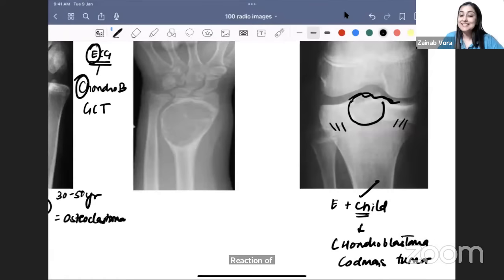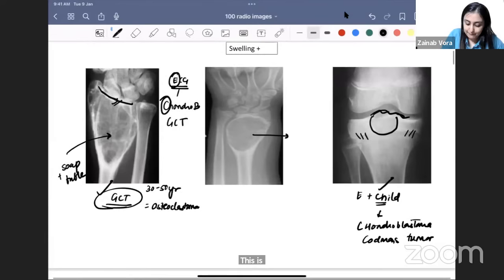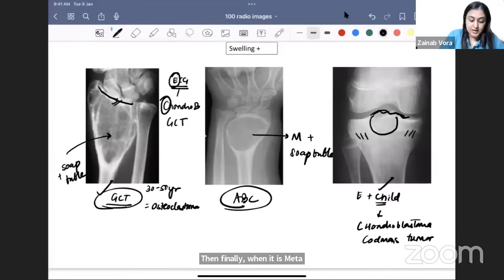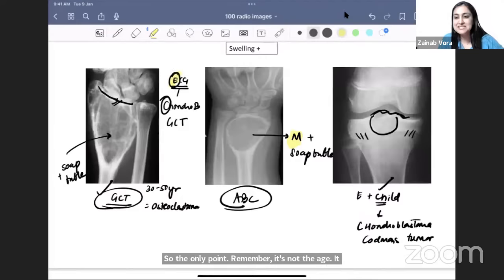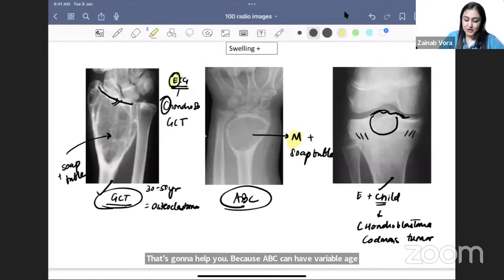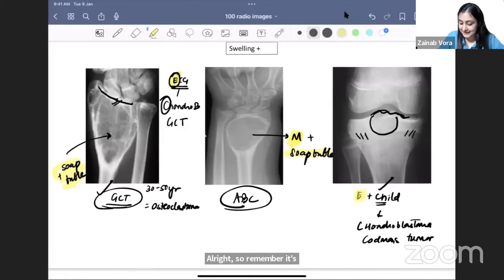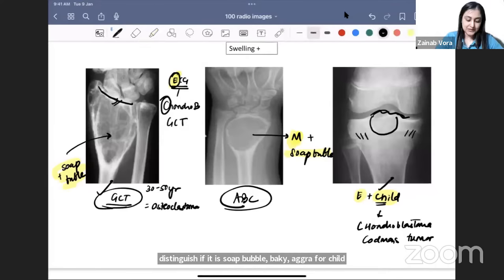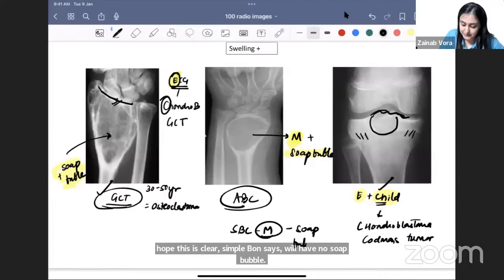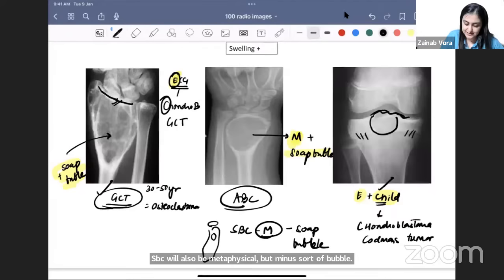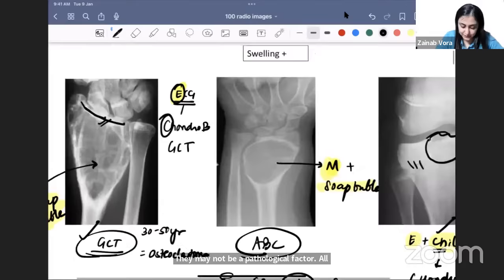Codman's triangle is a malignant periosteal reaction typically seen in osteosarcoma where the periosteum is lifted — no relation to Codman's tumor except the name. When the lesion is metaphyseal with a soap bubble matrix and trabeculations, it becomes an aneurysmal bone cyst (ABC). Remember, it's not the age but epiphyseal versus metaphyseal location that distinguishes them, because ABC can occur at variable ages. Simple bone cyst (SBC) will also be metaphyseal but without soap bubble — just a simple cyst, usually proximal humerus, with no trabeculations.